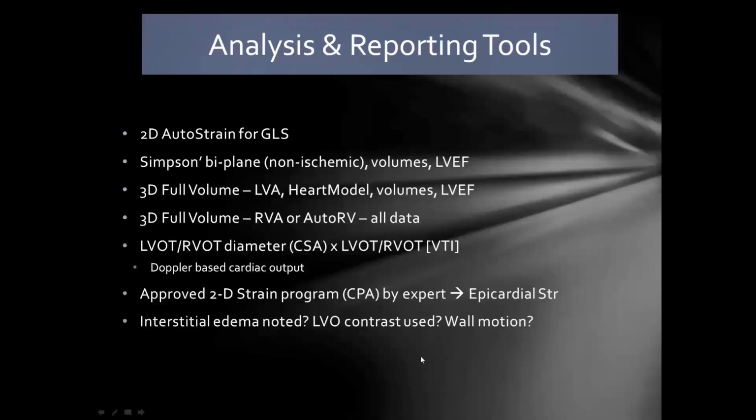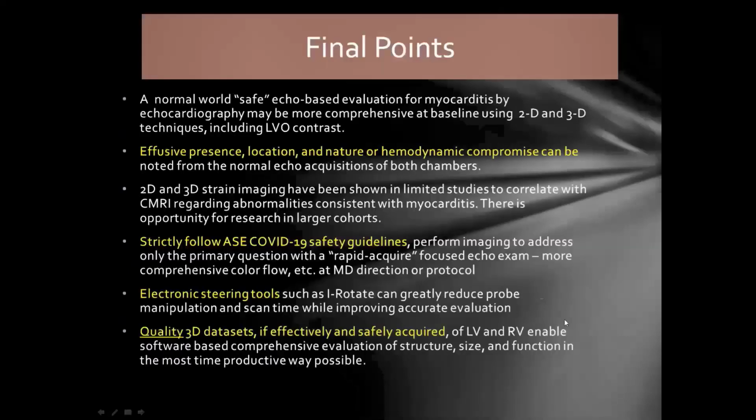And then note your interstitial edema. If you use contrast, was it used? Was it helpful? And of course, the wall motion.